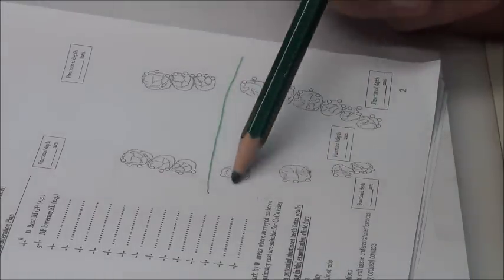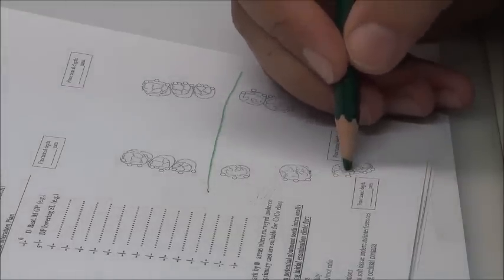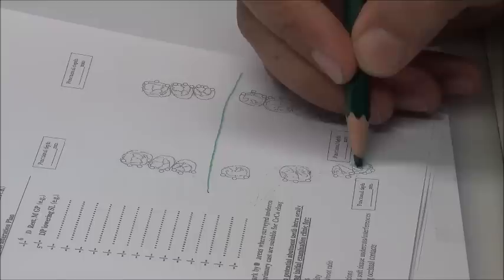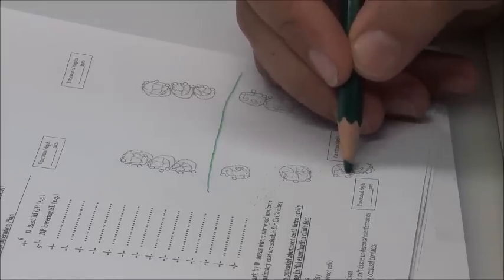So once more, 2 clasps on one side are sufficient. For a clasp here, I could eliminate clasps here and here because I have multiple abutments on one side and on the same side. This is another reason for minimization. If 2 abutments are adjacent, 2 adjacent abutments, I could eliminate retentive arms. Also, I could make double rests.